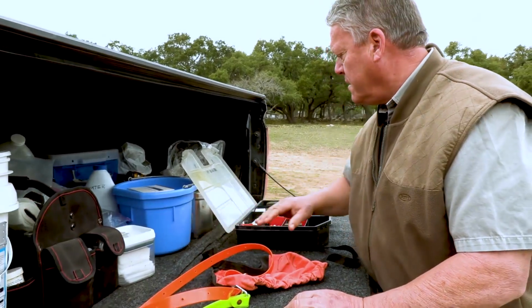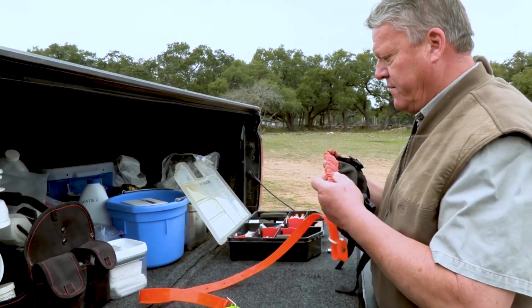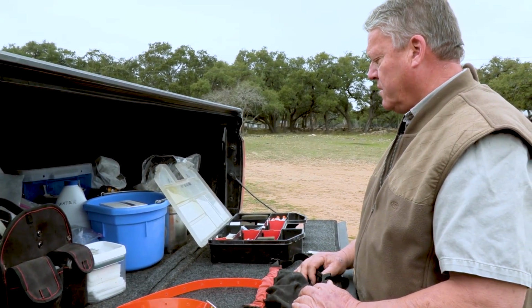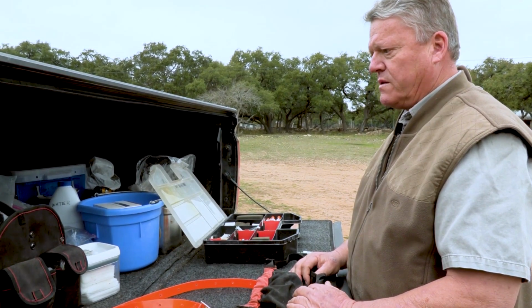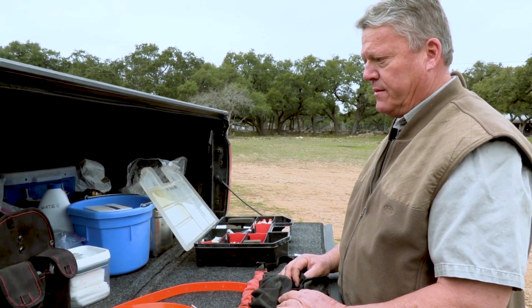So what I'm going to do is prepare a dart that we're going to immobilize her with. We'll have a mask that we'll put on her just to help her. We're only going to have her down for a few minutes. We're going to draw some blood and try to determine what has caused her illness, and measure some parameters that we can use to know what the prognosis may be.